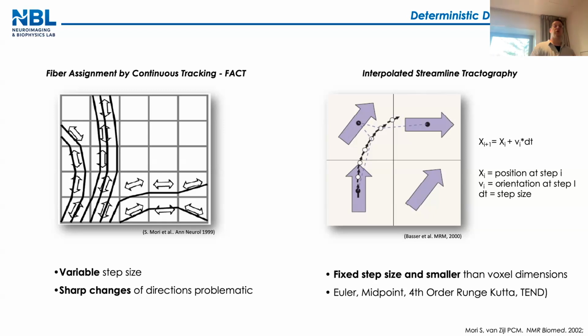You can bias it to be more bendy. As soon as you find a new direction, you can try to turn even more, or even, where is it, the TEND. The TEND was the first approach to try to solve crossing fibers in a very original way. I like it. Basically, you say, when I don't know where to go, I put down my head, go straight, and then I pass a voxel, look around, is there still anything that makes sense with my direction? If yes, I continue.